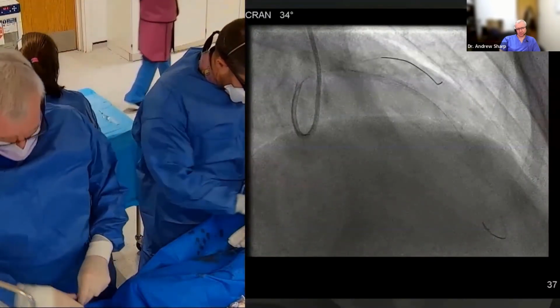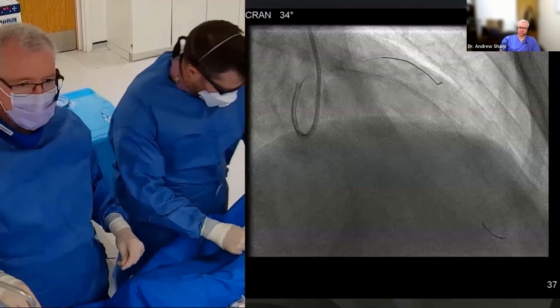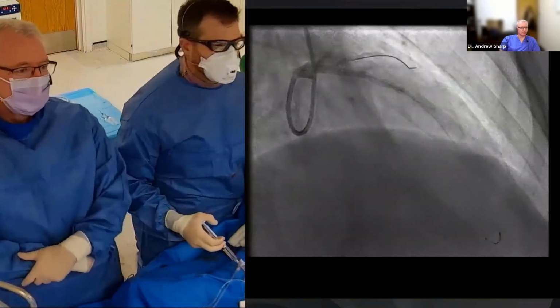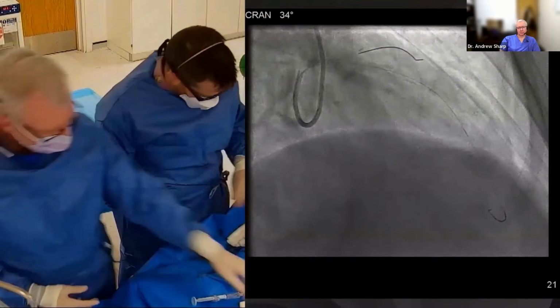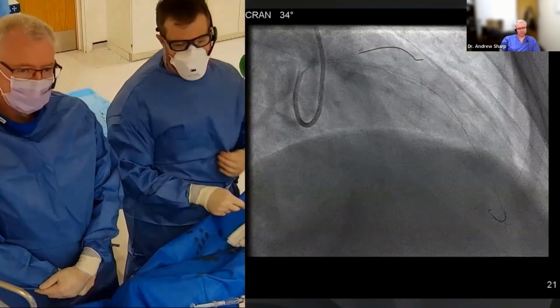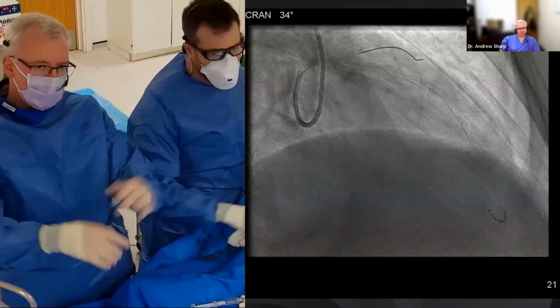So I think it's reasonable to post-dilate on the basis of your pre-IVUS, but you've always got to check afterwards. We might have to go back with bigger balloons because it could look different once we've released this. Agreed. Thank you, sir. And check you're okay. Yeah, and we look fine as predicted. Yep, great. And then if we have a 3.5/20 or a 3.5/15, something like that. And then a short 4.0, ideally an 8. So this is a long stent, 48.